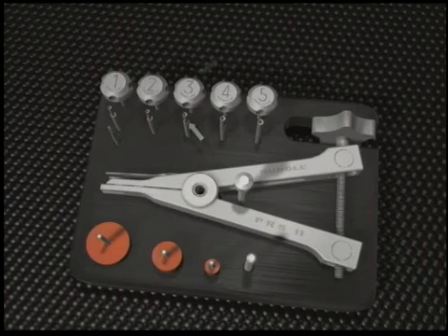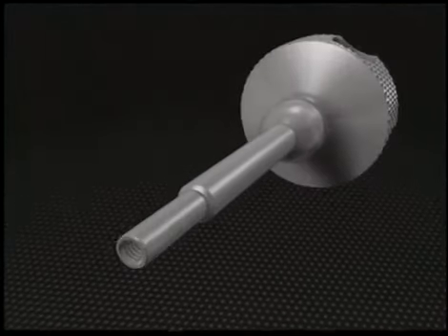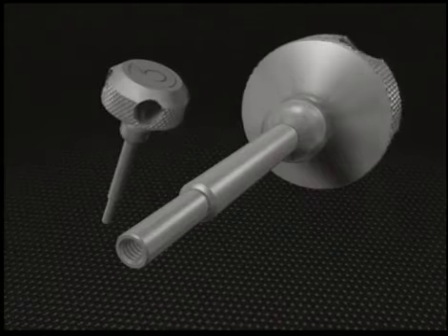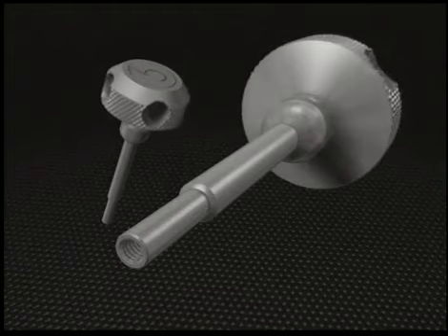As an example, using a number 3 trephine dictates the selection of a number 3 tap. The working end of the tap contains a tube that internally has left-handed threads and is approximately 4 millimeters in depth. The proximal end of the tap contains a well-engineered handle that is oversized to enhance motor control, beveled to provide comfort, knurled to encourage a sure grip.